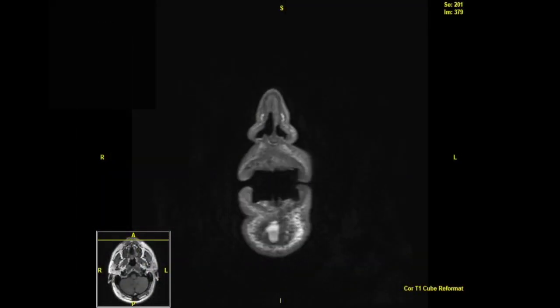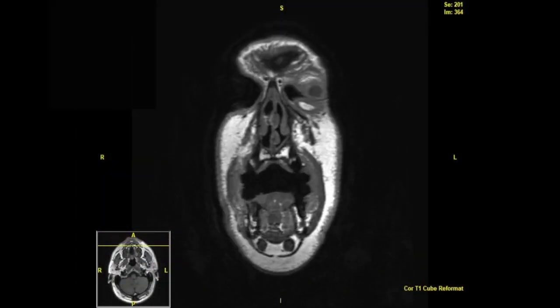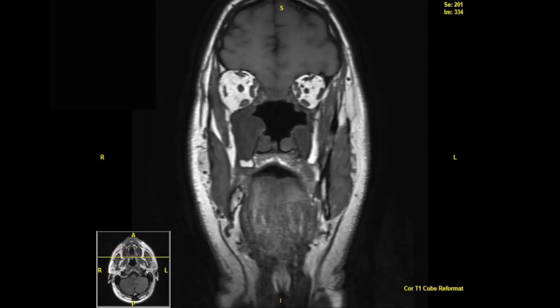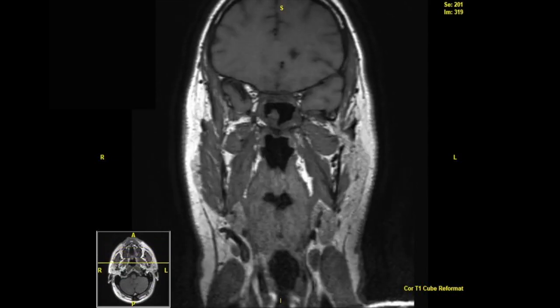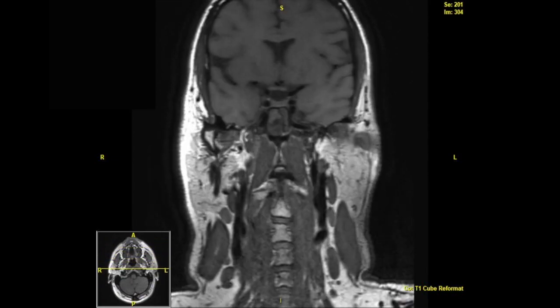Here we are with a post-operative MRI scan about one month after surgery, demonstrating an excellent resection.